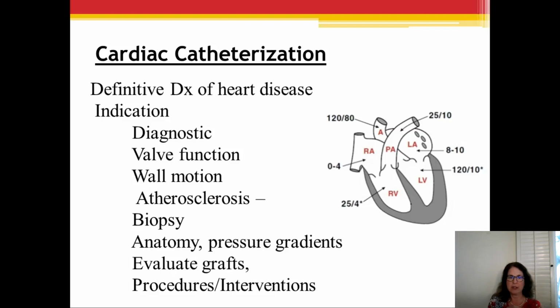So let's say somebody has a vessel disease, okay, and this vessel's clogged. Then I'm measuring the pressure before it and the pressure after it, and then I'm comparing the gradient. So in a normal vessel, there should be no gradient, right? It should just be normal. But if there's a 70% difference in the pressure, then I have a 70% blockage. Where's the gradient? I'm looking at atherosclerosis.